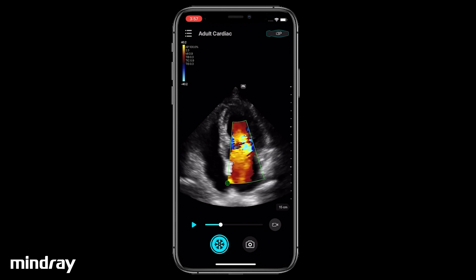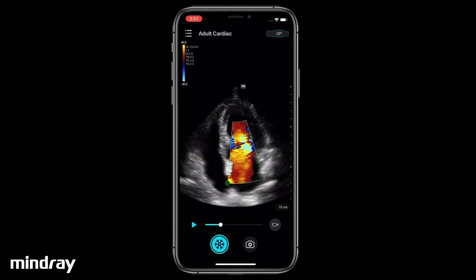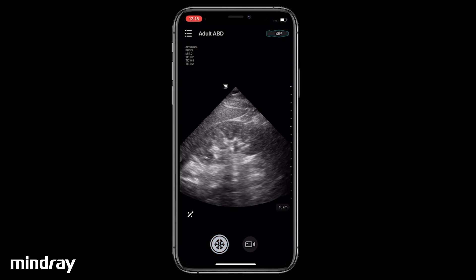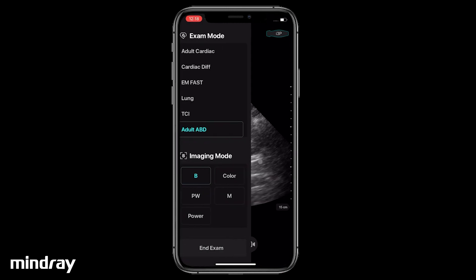Tap the Camera icon to save an image, then tap the Video Camera icon to save a Cine. The operation will be the same in Power Doppler Mode.